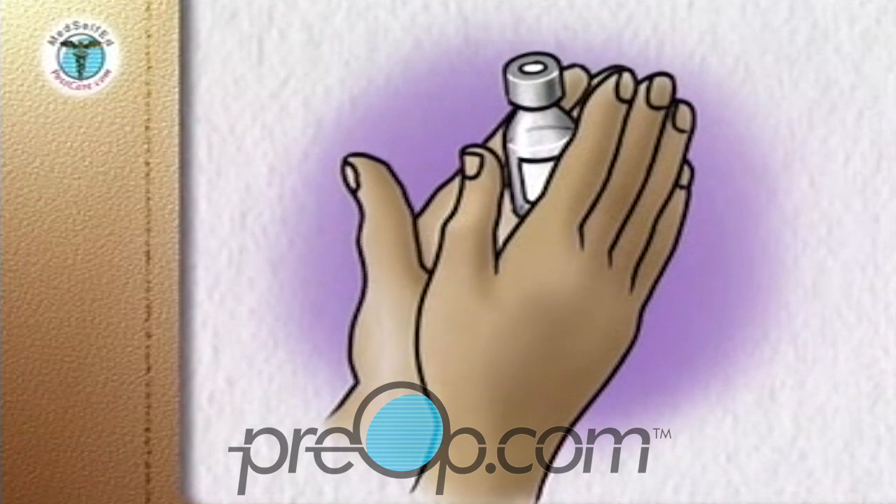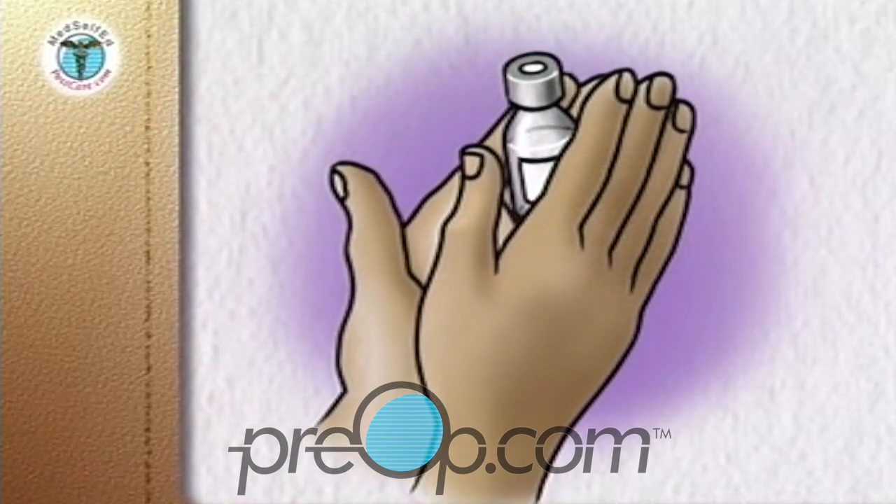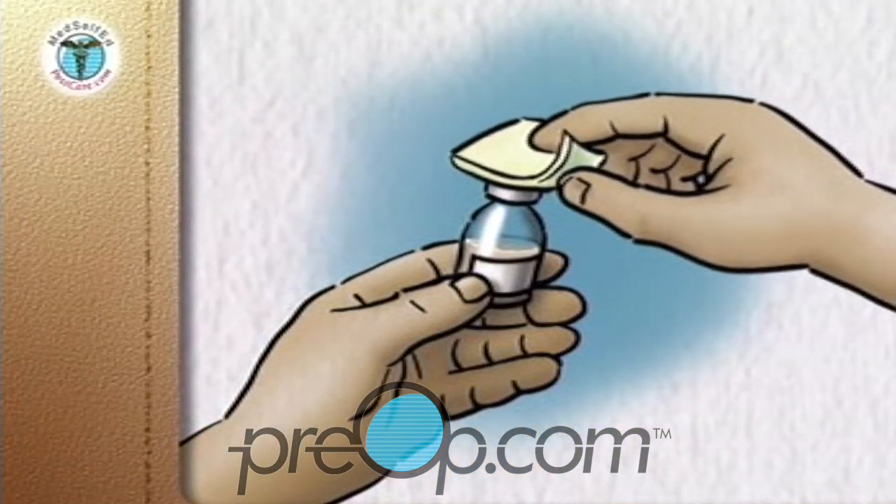Roll the bottle of the cloudy insulin between your hands to mix it. Clean both bottle tops with an alcohol wipe.